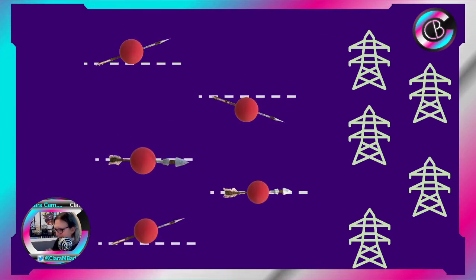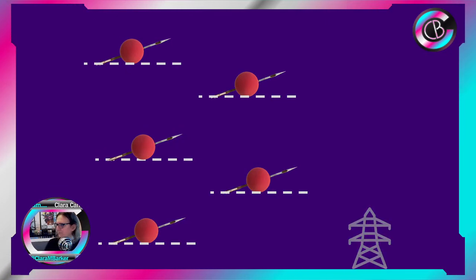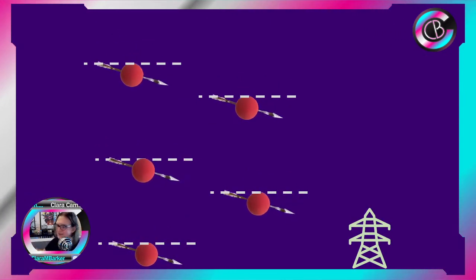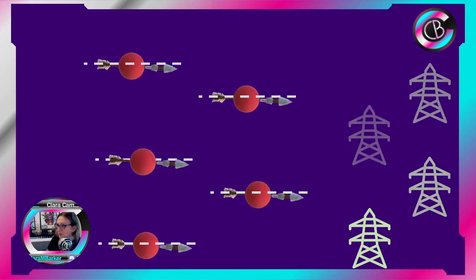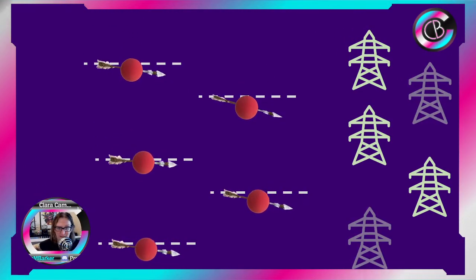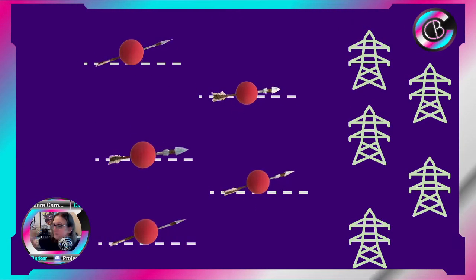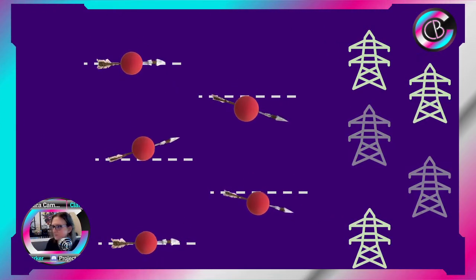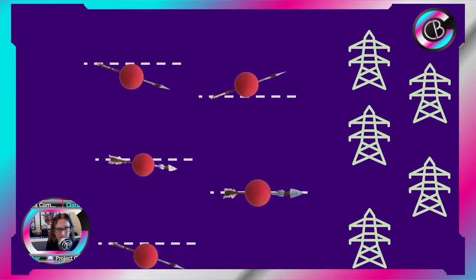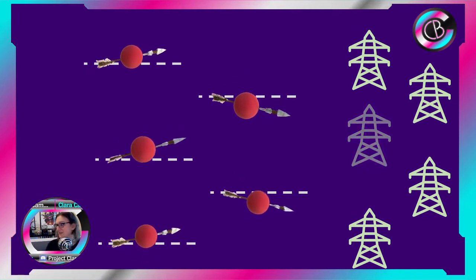So if we've got the hydrogen which is in fat and the hydrogen that's in water, we can tell the difference by measuring the energy coming off them. All these different energies, we know what they are, and so you can have a computer monitoring when this energy is being released and how much is being released, and you can say this is exactly what this is, and you can build up an image of that. And so that's what we're doing with MRIs, basically. I think it's really cool.